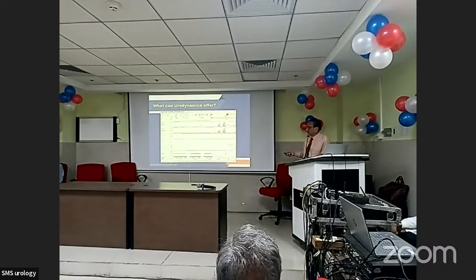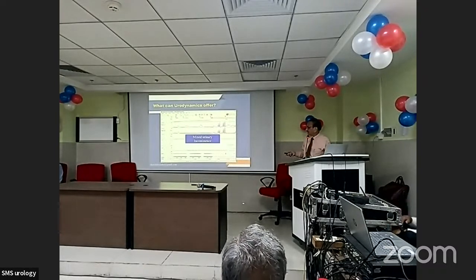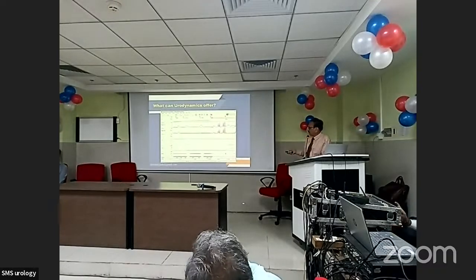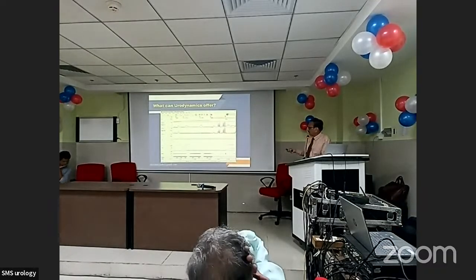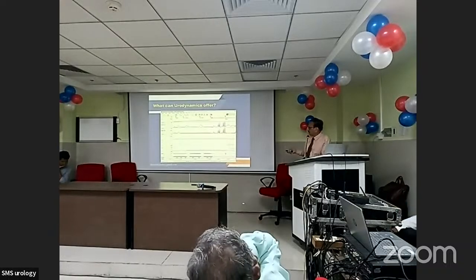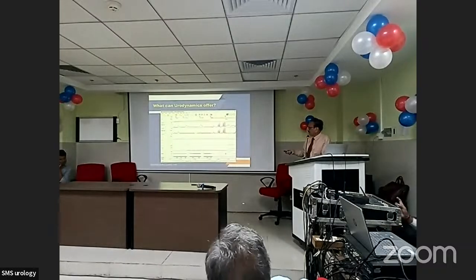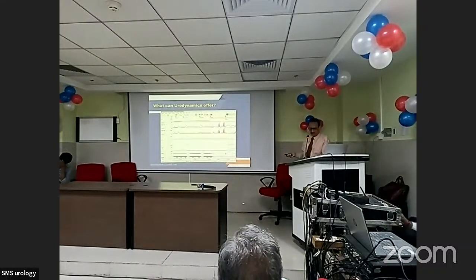Now, I don't mind showing this slide. Mixed incontinence. So again, the same thing. She has leakage here. The important thing is the quality of tests. You must always make sure that the quality is good. How do you know that? The subtraction is good before the voiding, and the subtraction again confirms good quality after voiding. So whatever is recorded in between must be valid. Here as well, the same thing. Subtraction must be good all the time.